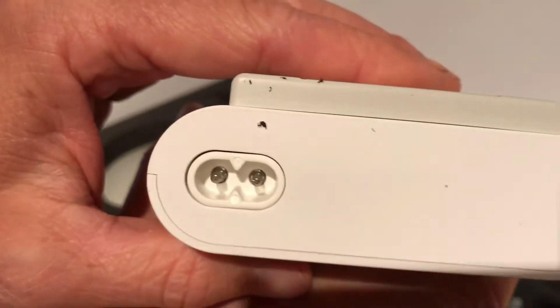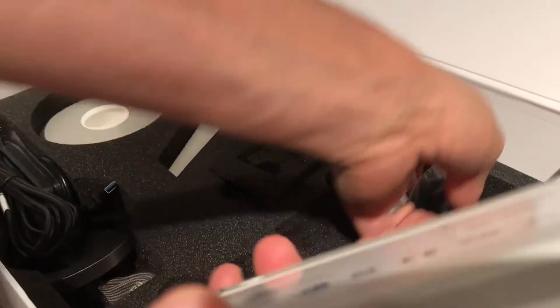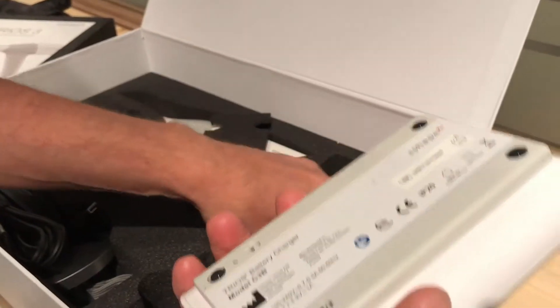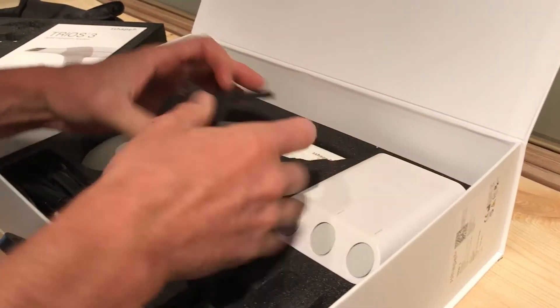At the back of it is just where you plug in the actual charger. There are some other bits and pieces down here — it looks like a backing plate, so you could actually hold this on the wall. It would be like a flush wall mount for it, and it's got the screws for it.